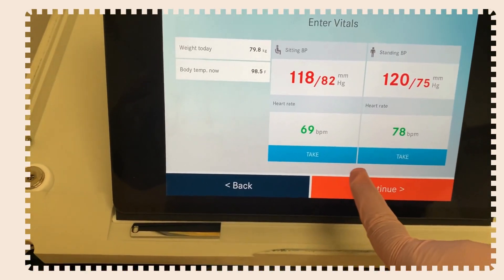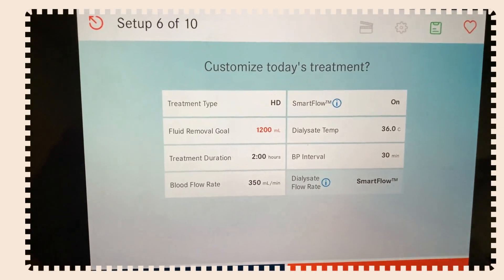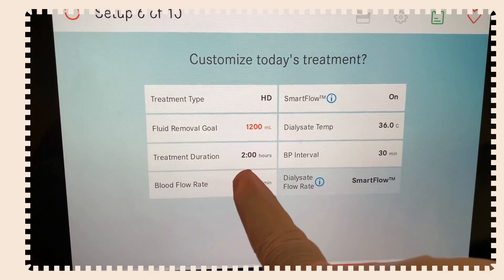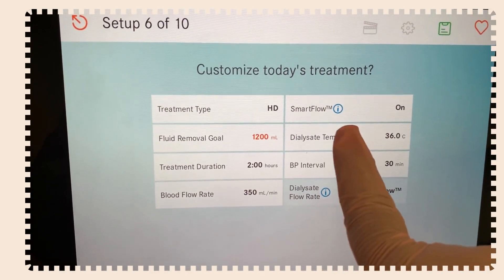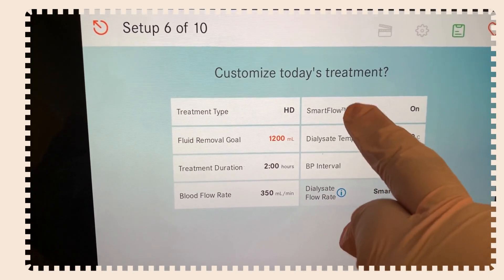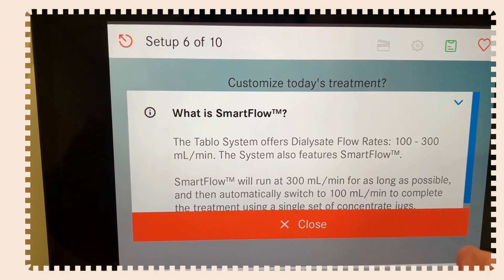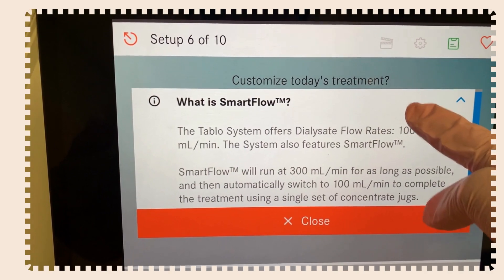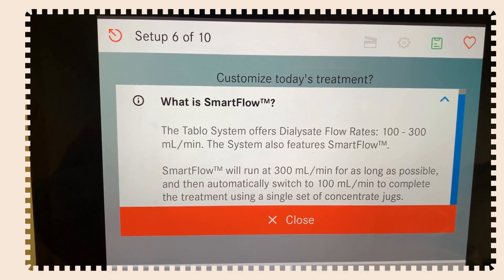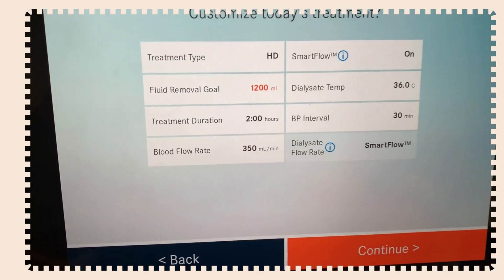Hit continue to review treatment settings: treatment duration, HD mode, fluid removal, dialysate temperature, and smart flow. If you have a question about any setting, click the info icon. The Tableau system offers dialysate flow rates from 100 to 300 mL per minute. With smart flow, it will run at 300 mL for as long as possible and then switch to 100 mL so that you work off one jug.